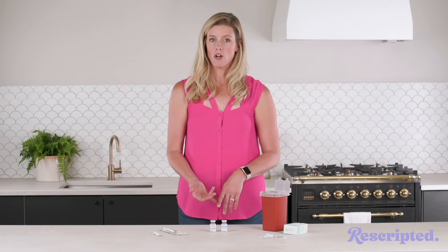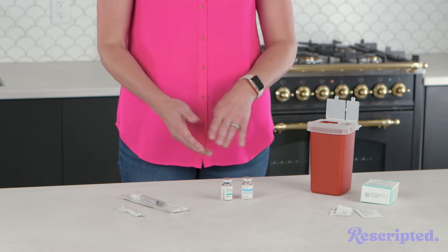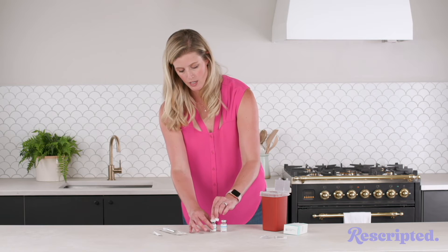Also don't forget your alcohol pads and your sharps disposal kit. To get started, these vials have little plastic caps — you're just gonna pop them off. Then use your alcohol pad to wipe down the tops of those rubber stoppers.